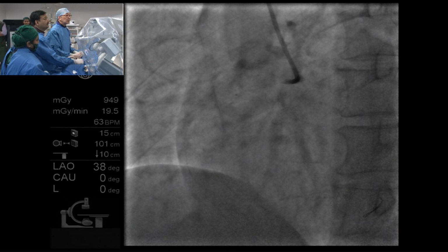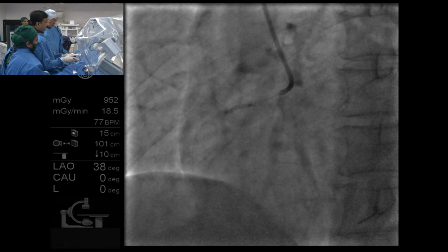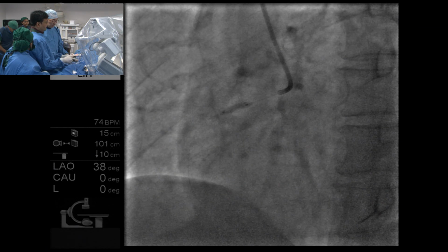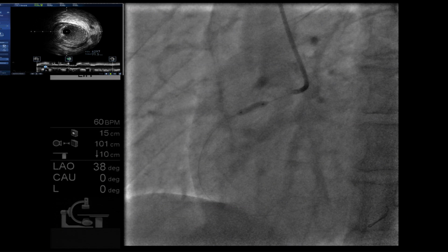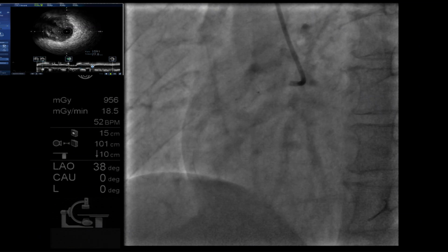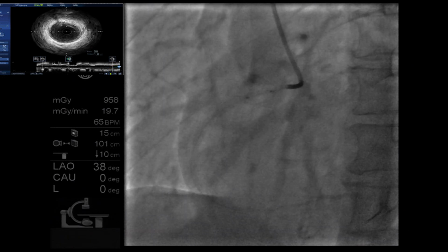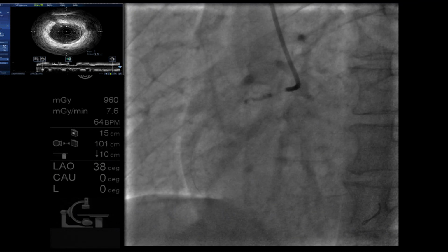Good. All right. Open. There's a bubble here. What is this balloon, Sanjay? A 3x10 Flexotome. Heart rate is slow. That's okay. One more cut. Going up. The heart rate you can see drops a little bit once they cut.